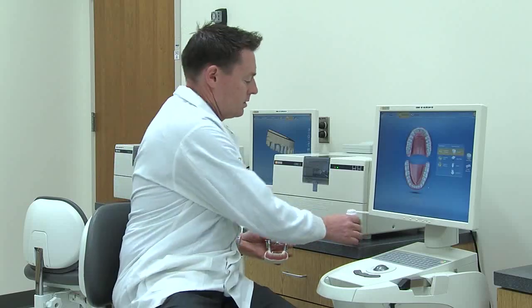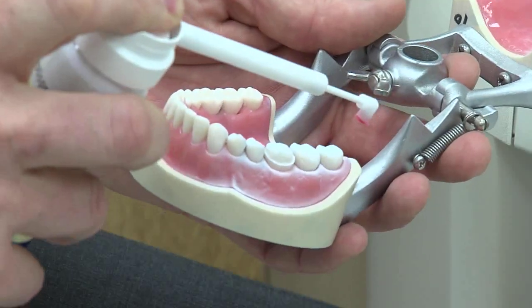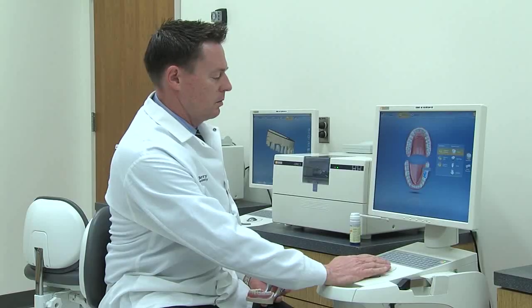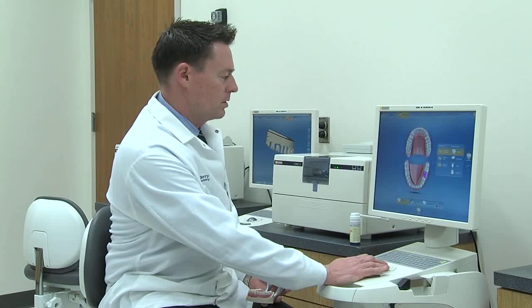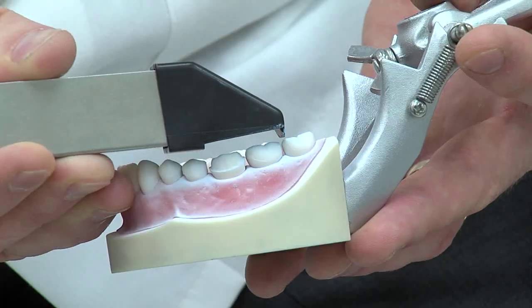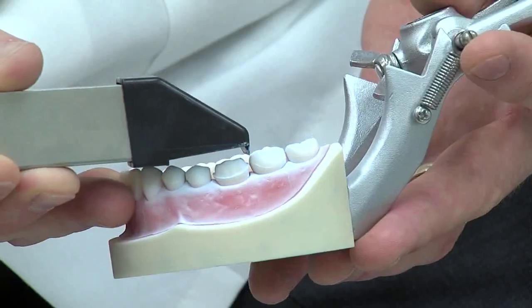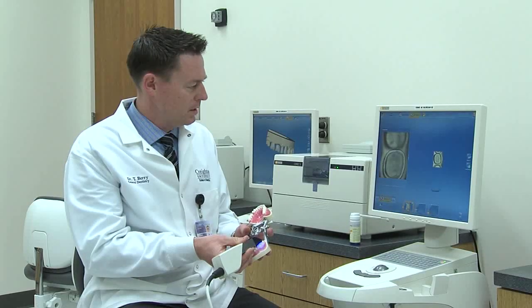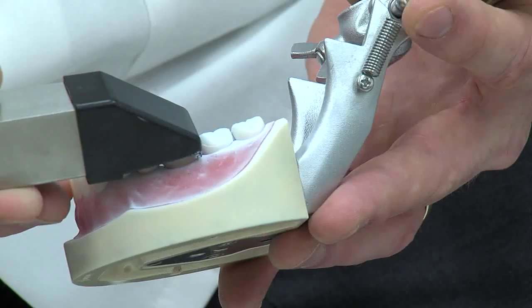First thing we need to do is powder our preparation for our Acquisition Center. Just a couple quick passes, and then on our computer screen we just need to tell the computer what we're doing — we're choosing tooth number 19, a single crown. And now we're in the Acquisition phase. With our camera we're going to capture the preparation and the adjacent teeth.